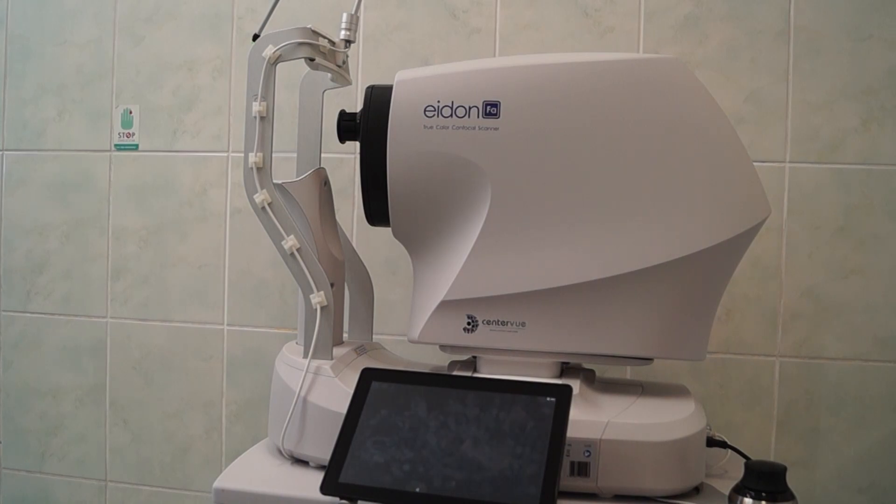Another useful feature is that most commonly used printers have their drivers already pre-installed, so the device is ready to connect via Bluetooth or LAN to your own printers.